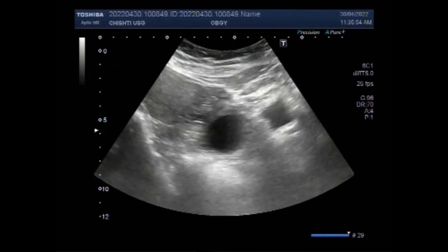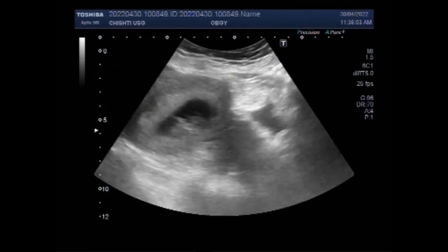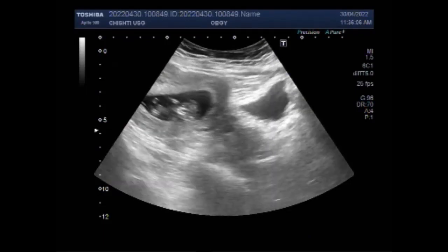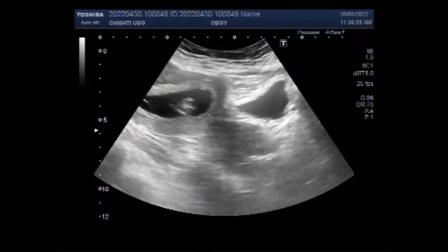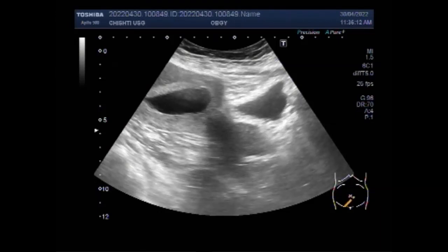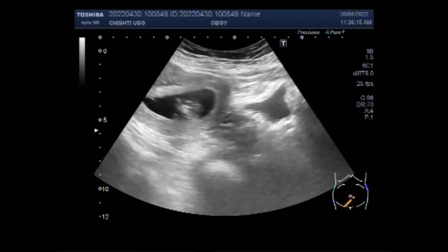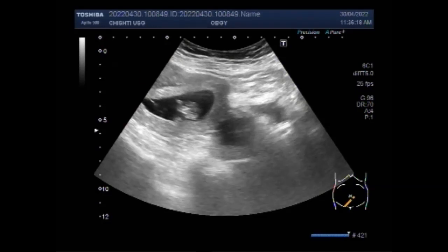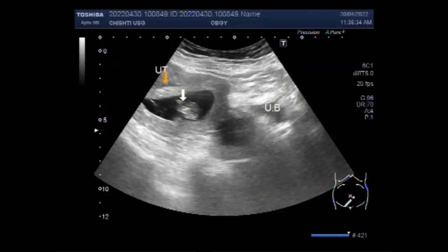This ultrasound video shows an early pregnancy of about 10.5 weeks with an ovarian cyst. You can see the uterus having a gestation sac and a small fetus of about 10.5 weeks. The fetus has fetal cardiac activity, fetal movements, and blood flow is also seen in the fetus.